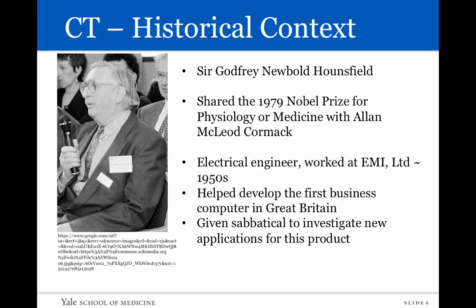Enter this gentleman in this photo over here, Mr. Hounsfield, who in fact shared the 1979 Nobel Prize for Physiology or Medicine for the discovery of CT imaging. And by trade, he was an electrical engineer. He worked at EMI in the 1950s, and he helped develop the first business computer in Great Britain. And once he helped develop the computer, he was given a sabbatical to investigate potentially new applications for this product. Lucky for the world and medicine, he had some interest in imaging and focused his research on that.